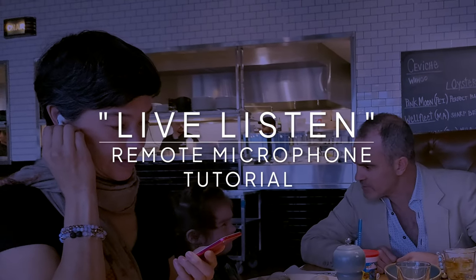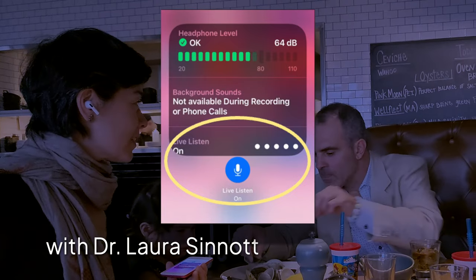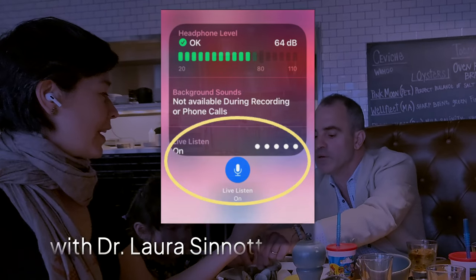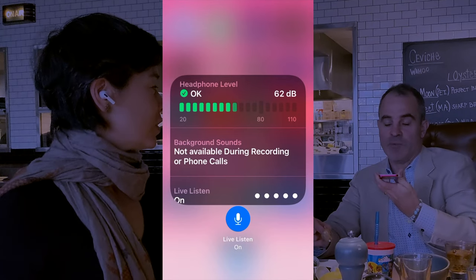Dr. Laura Sinnott here, audiologist and audio engineer with TUNED. I'm going to show you how to use Live Listen, a remote microphone built into your iPhone. It might help you hear better in restaurants or any loud environment.